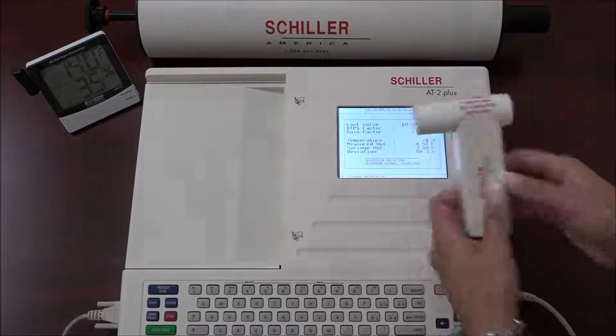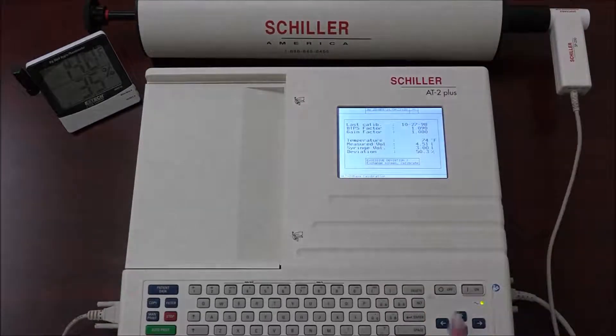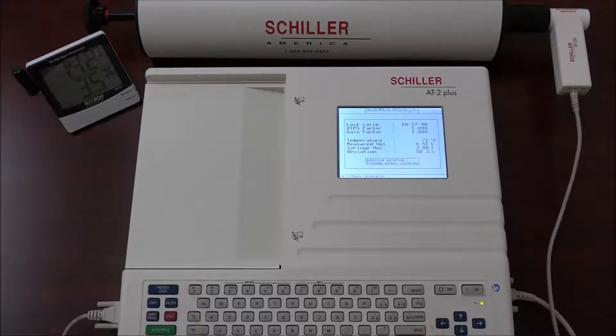Before recalibrating, the stored calibration values must be reset. To do this, press the ALT key N1. Press the PRINT-COPY key to obtain a printout of the calibration report with measurement details, time, and date of calibration, and a graph of the calibration.